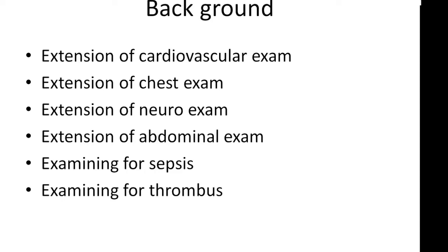So ultrasound, showing us the anatomy and the pathology, can be an adjunct and certainly enhance the clinical examination, often leading to diagnosis, changing differentials into diagnosis. Not in all cases, particularly in medical cases, a lot of the pathologies are above the diaphragm, but it can be of use, and I certainly use it in medical patients examining for all of the above. So let's have a look. The cardiovascular exam.